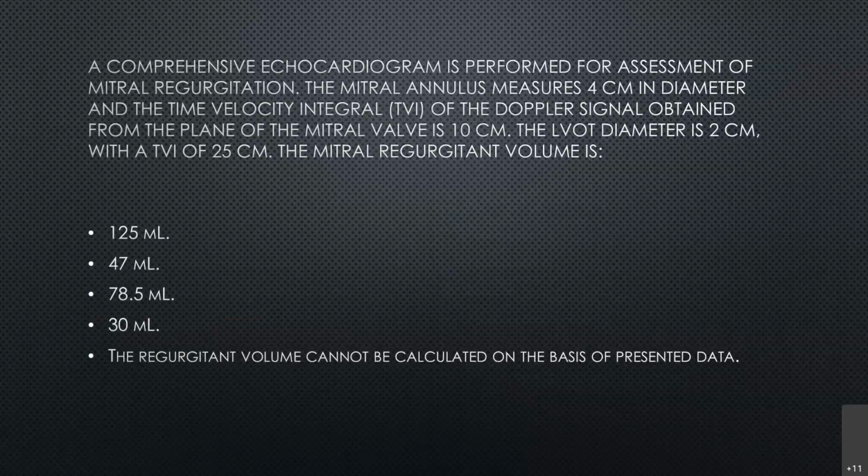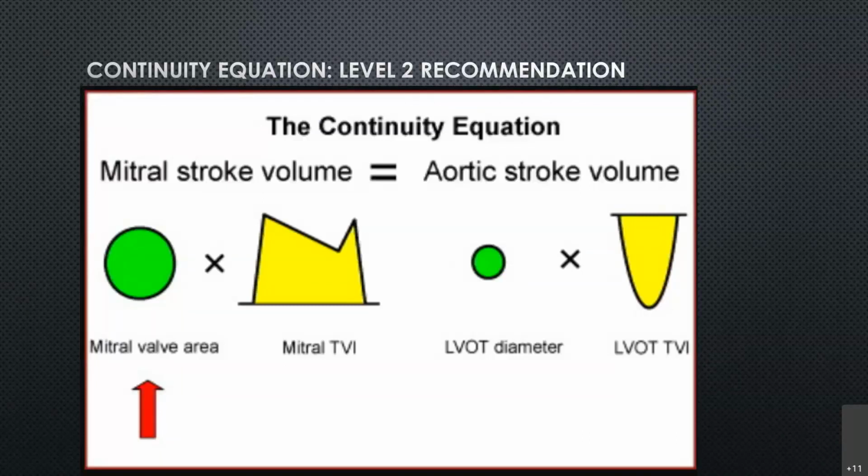Yeah, it's the math that you need to check, but the concept is absolutely right. It goes back to the continuity equation, and you can use this for mitral stenosis as well. It's not just mitral regurgitation. I'll wait for your math a quick second. If not, we'll start discussing the continuity equation and why in MS.